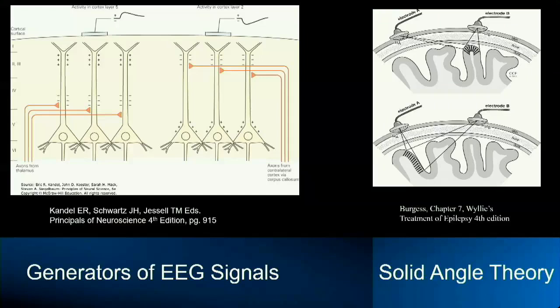So that downward pen deflection is created by that negative source at layers 3 and 4, and is best seen when this is in a vertical structure, vertical organization. In a vertically organized dipole, the scalp EEG beautifully sees the structure, sees the activation. When it's tangentially oriented, such as within a sulcus, the EEG electrode has a much harder time seeing the source.